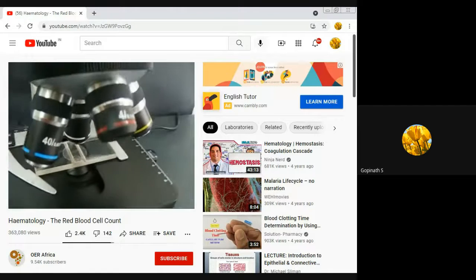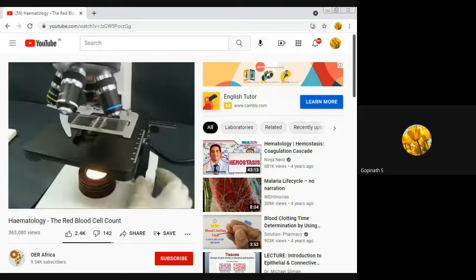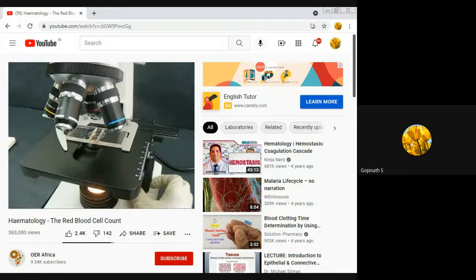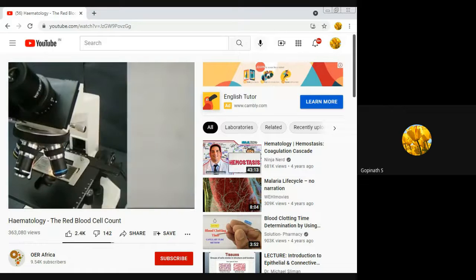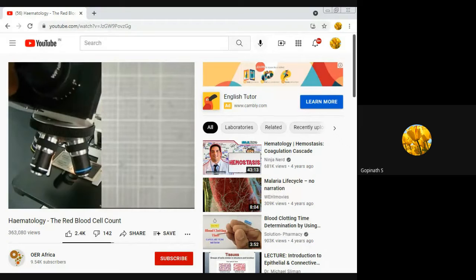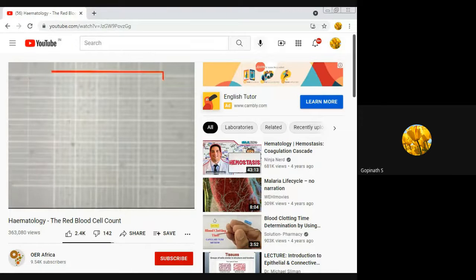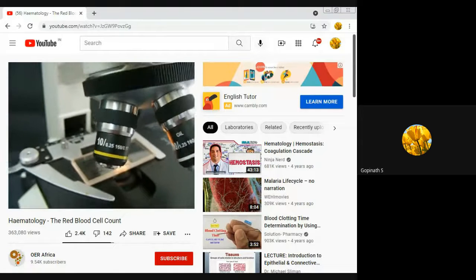So this is the older method for measuring the blood cell count, okay, through microscopes. So inside the 0.1 mm depth column, they are just going to add the blood content. Okay. Now they are going to look into the blood cell counts through the microscope. Around 500 magnification, they are going to look at the blood cell count, that is RBC and WBC.